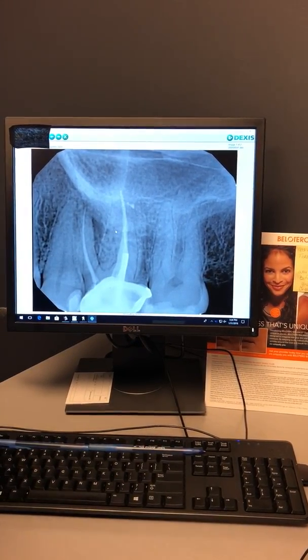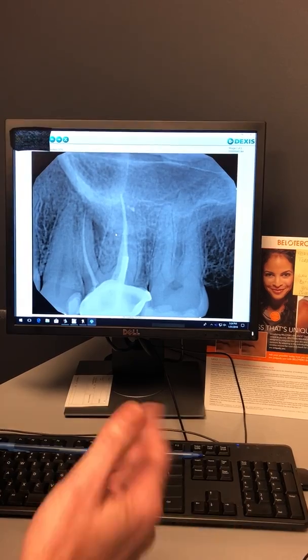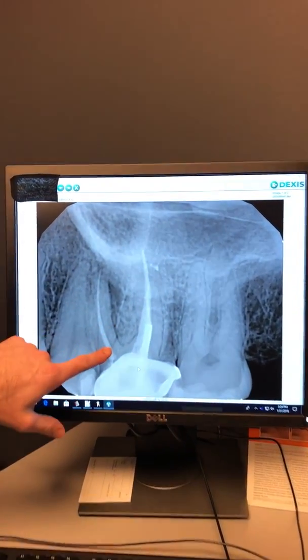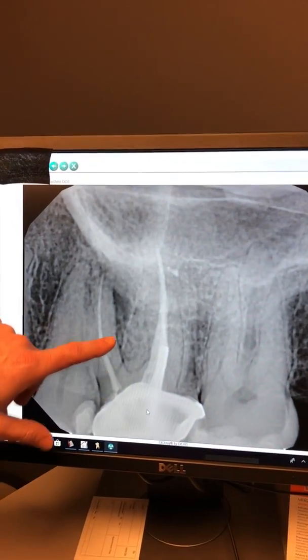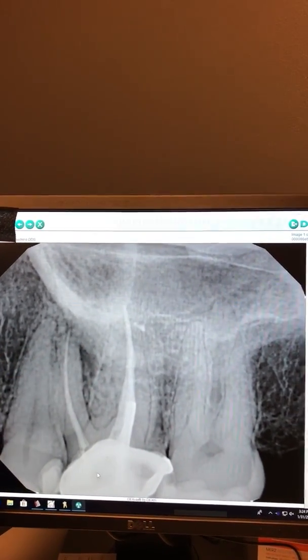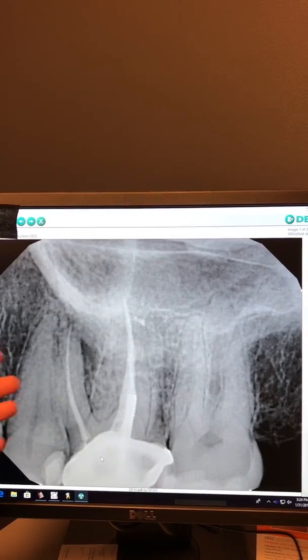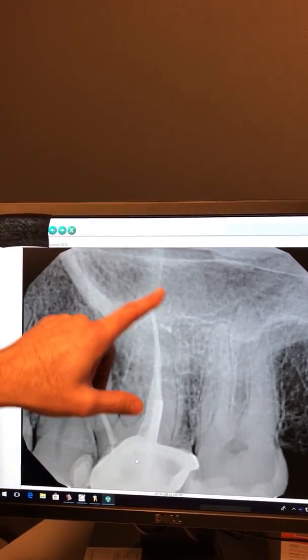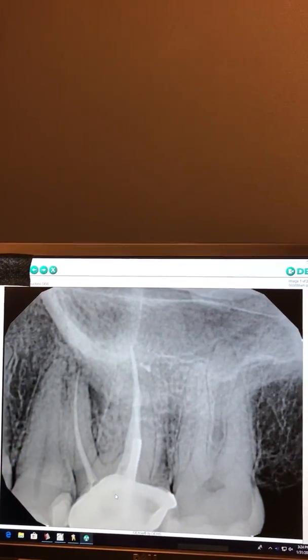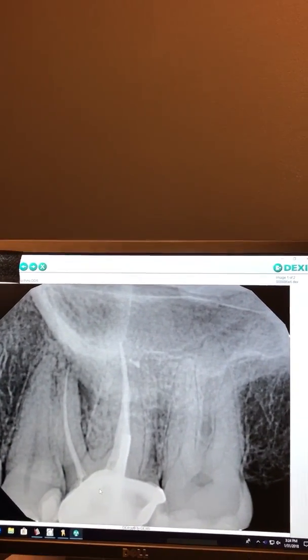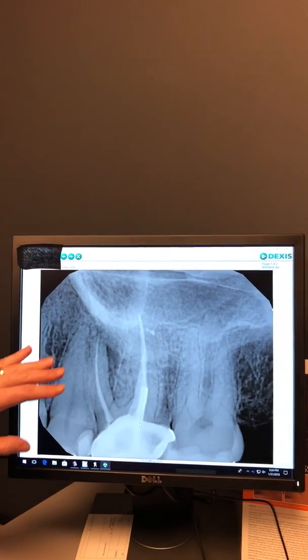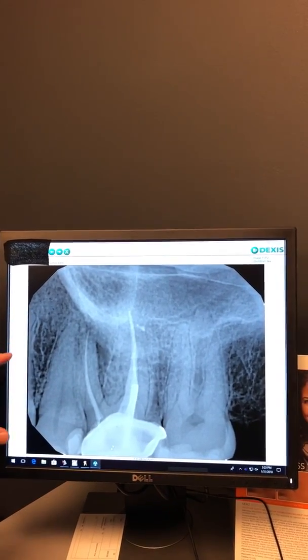She thought maybe she'd get sinus infections from time to time and that's why the tooth hurt. We saw her recently and took a two-dimensional digital x-ray. You can see that maybe there might possibly be a little bit of infection here, but it's not real clear. Looking at the tips of the roots, we don't see infection there, so the root canal looks okay — we're really not sure what's wrong.